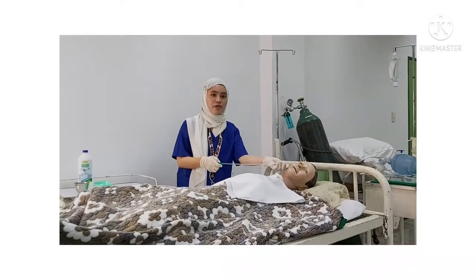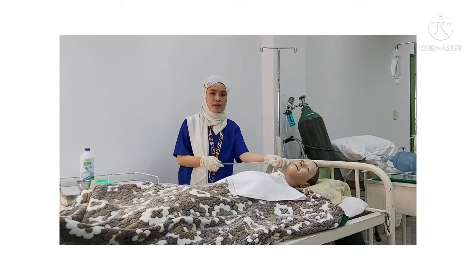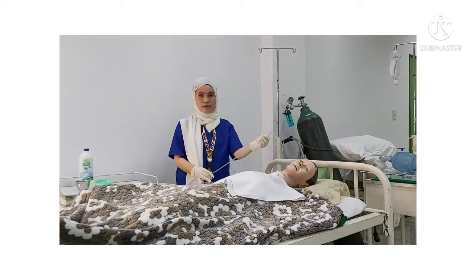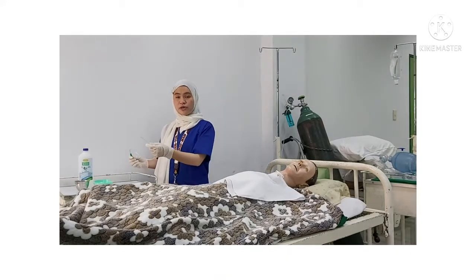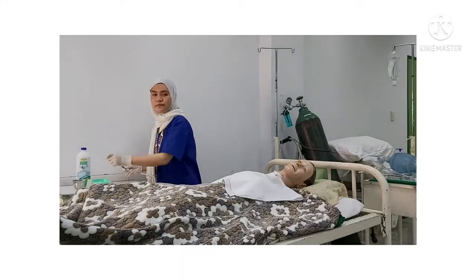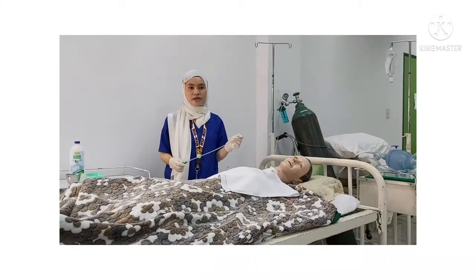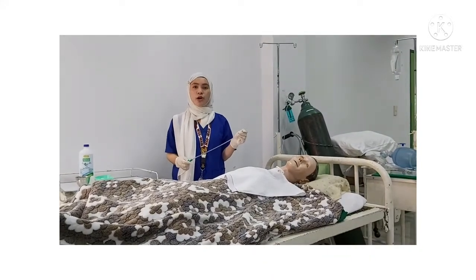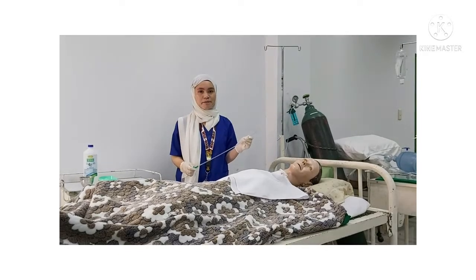Now release suction and withdraw the catheter completely. Flush the catheter with a saline solution or sterile water to remove any secretions. Repeat suctioning as needed and according to the patient's tolerance. Applying suction for too long may cause secretions to increase or may decrease the client's oxygen supply.